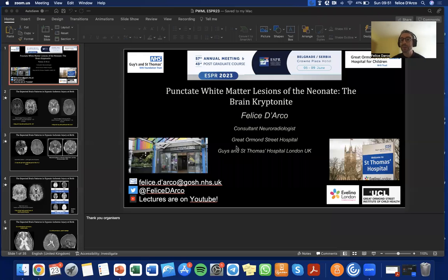Today, while I'm sharing my screen, I'm going to speak about a very controversial and interesting topic: the punctate white matter lesion of the neonate, that somebody called in one beautiful paper the brain kryptonite.